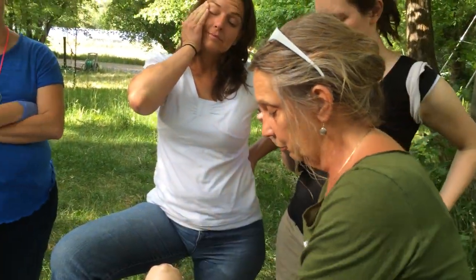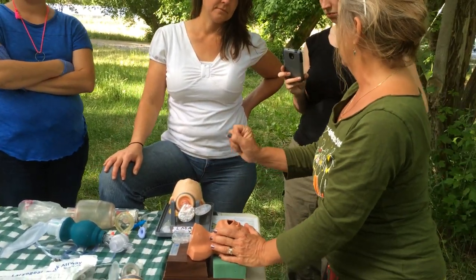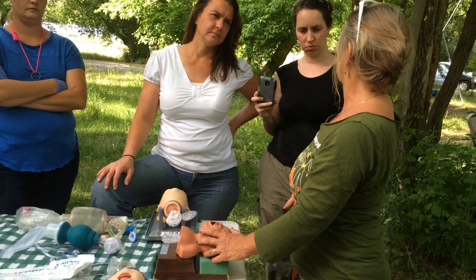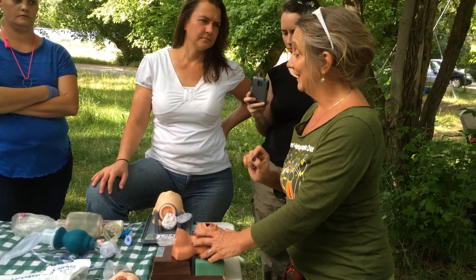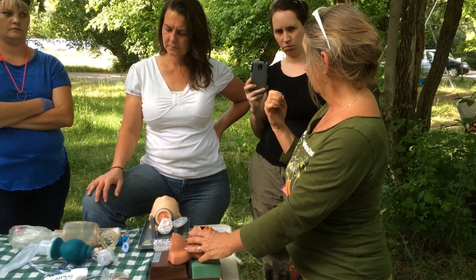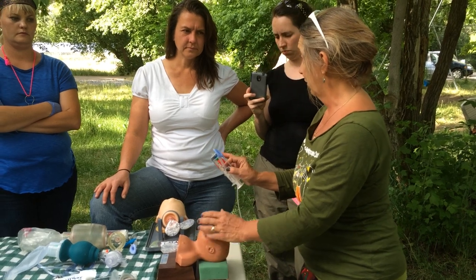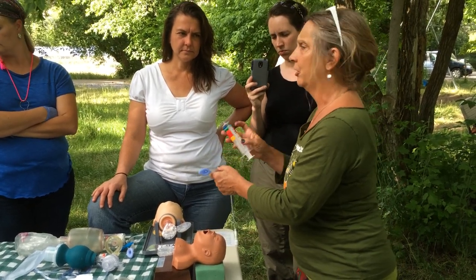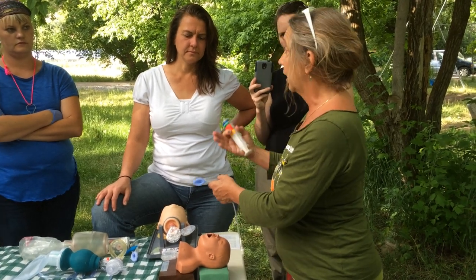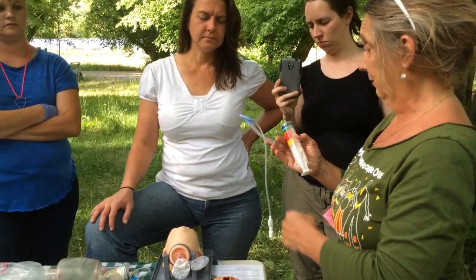So what you're going to do when you open up your packet: you've been bagging your baby long enough that you start to feel resistance because the air is going in the baby's stomach. So now you've got to degas the baby's stomach and then take that orogastric tube out and then move to your LMA. Usually that's a little more than 2 minutes, but it might be up to 5. If you're still not getting response from your baby, you better move to the LMA and degas that stomach.